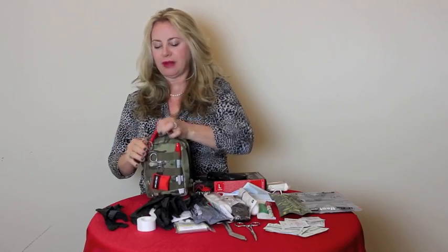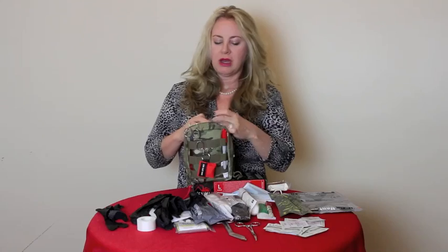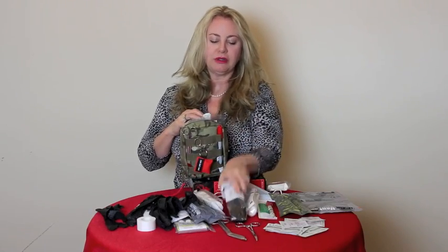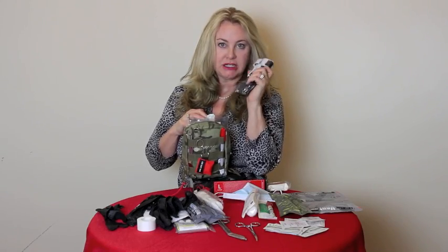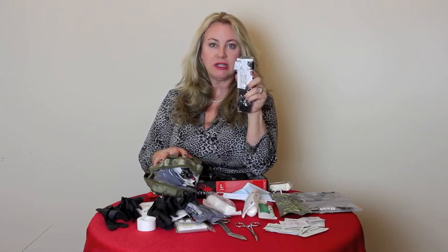We have, right behind the decompression needle and the scalpel, our CAT tourniquet. Now, the CAT tourniquet is important because this is what's going to stop the bleeding. This is your measure after you have used your gloved hand and some gauze. That didn't work. You're going to have to move to the tourniquet. It's not something you're going to choose easily. It could damage somebody's body.